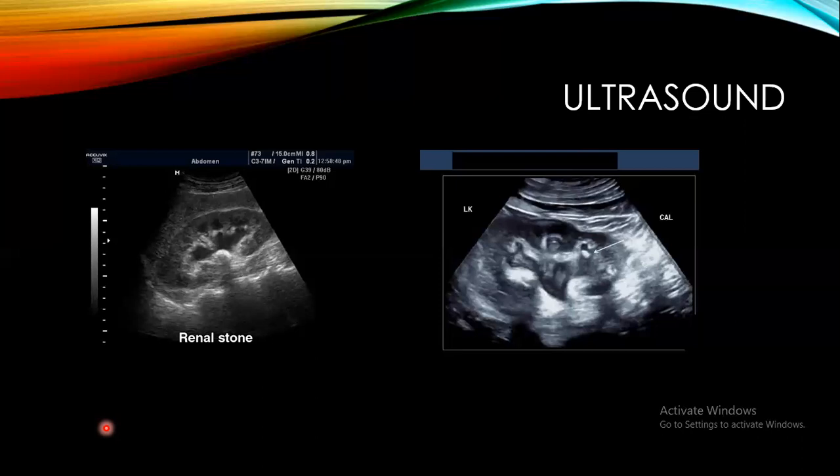And the ultrasound usually needs a media in between the probe and the body in order for the wave to pass directly downward toward the organ. الموجة الصوتية عادة تطلع من البروب من هذا المكان. كل ما تبتعد الموجة الصوتية عن المركز مال البروب، كل ما يزداد الدايمتر مالها، وبالتالي راح يسوي لي سكانينج للانترنال اورجان. يعني أول ما تبدي بالسكن، ولازم يكون بين السكن وبين البروب ميديا، وهذه الميديا تساعد على انتقال الموجة الصوتية بسلاسة. والميديا طبعا هو عبارة عن جل like the body gel or antiseptic gel or even water.